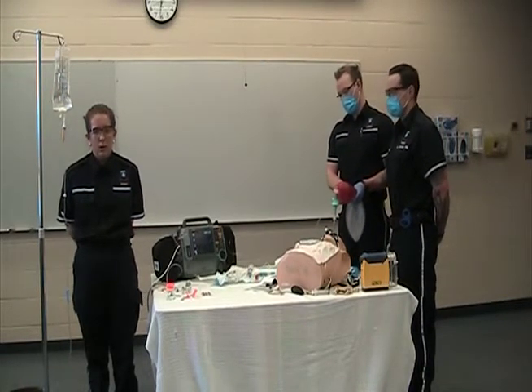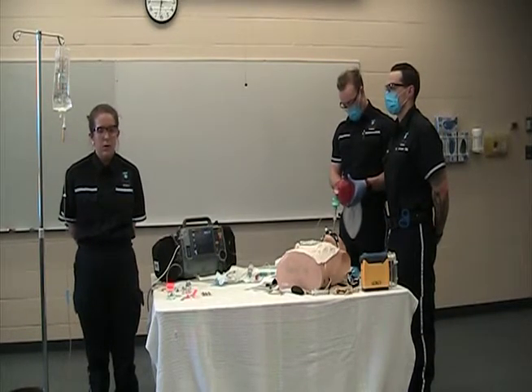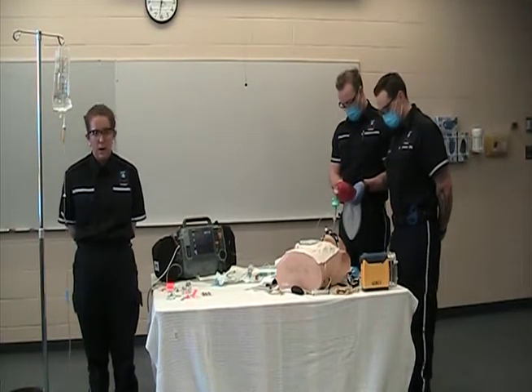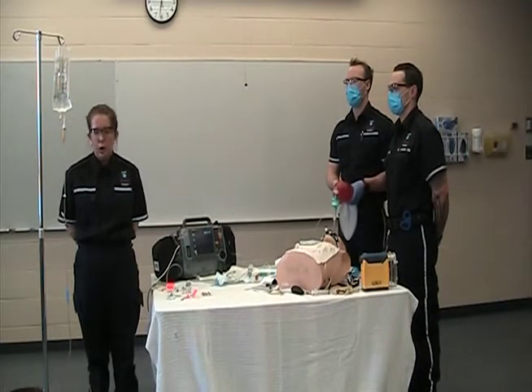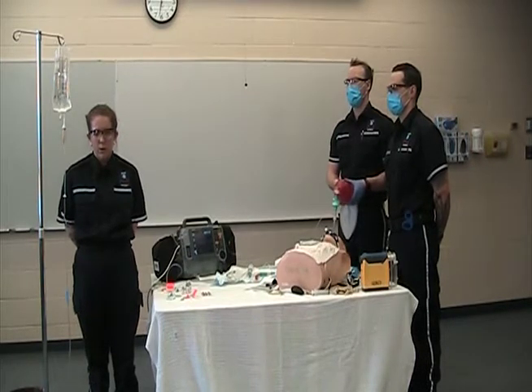So if we notice any difficulties with bagging, we're going to go through our D, which is displacement. So we'll check at the teeth, make sure that it's still where we marked it down. If it's not, we can reposition and do our 6 confirmations again. Moving on to O, we'll check for any obstructions. So if there's any fluid, we can do a deep tracheal suction.